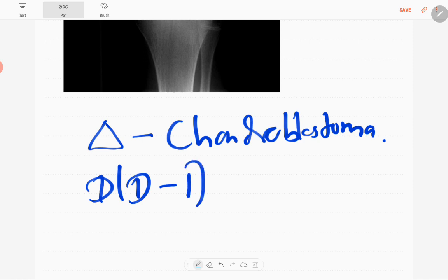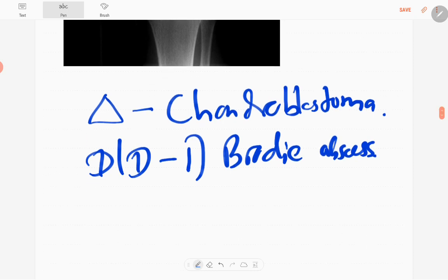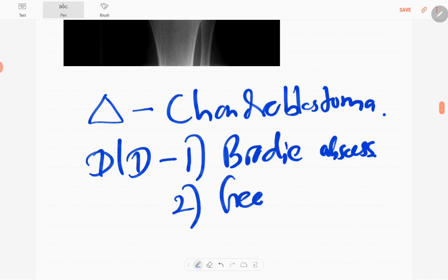The differential diagnoses: if there's a history of fever or trauma, then you have to think of Brody abscess.